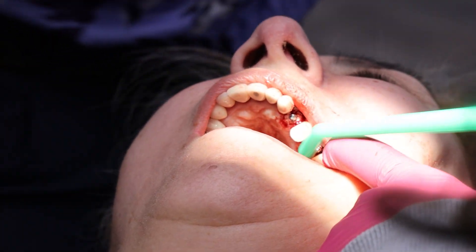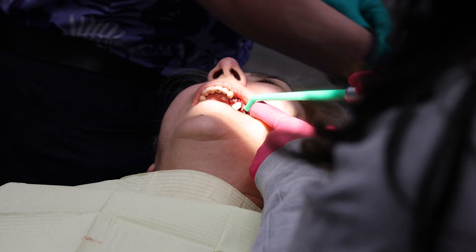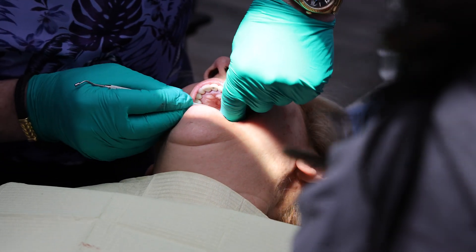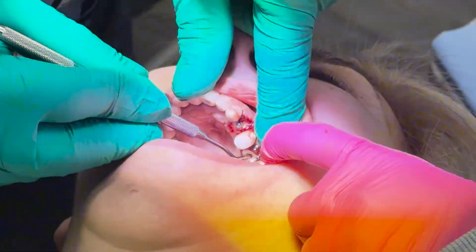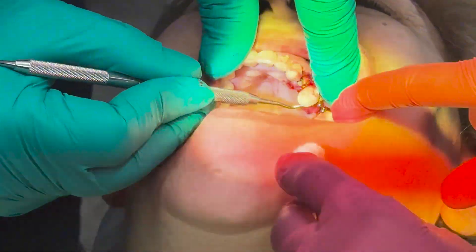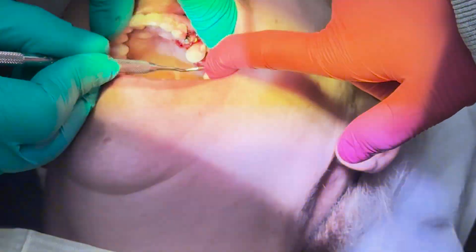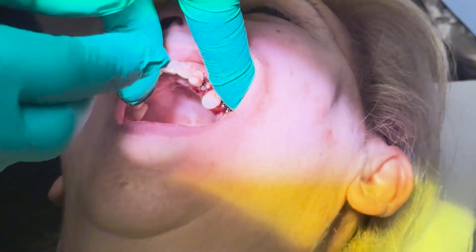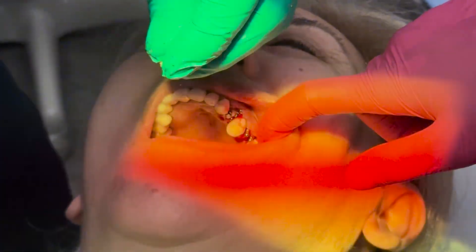Another plug of collagen — here's another bovine collagen. This is the Shatkin First Restore Plus. We're packing that socket. Pack the socket with that. Stay tuned after this video for our special introductory offer on the Restore Plus product.